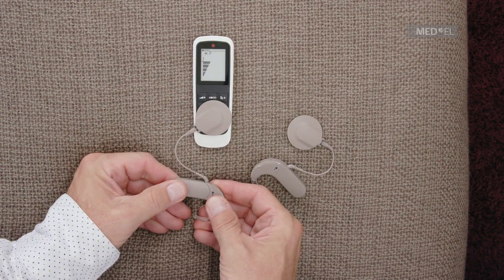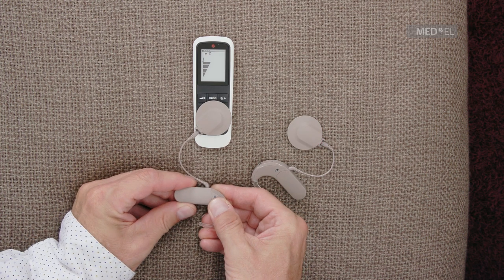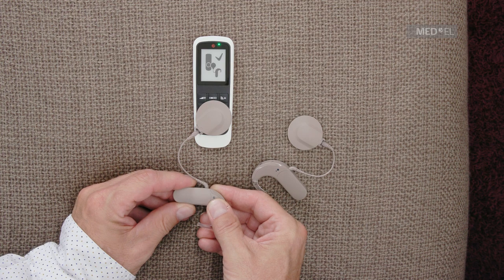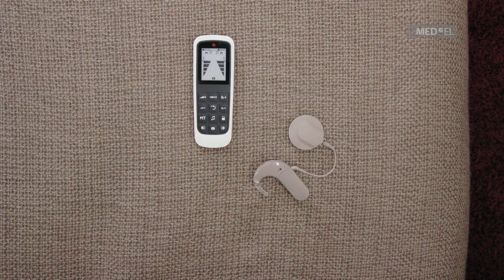If your processor does not pair immediately with the FineTuner Echo, try again. If it still does not work, please contact your audiologist to check that your audio processor is programmed correctly.